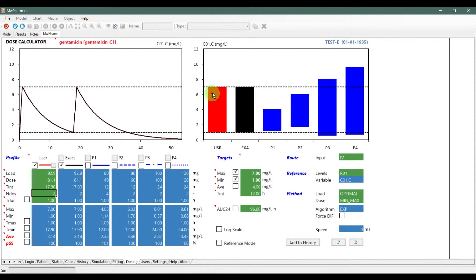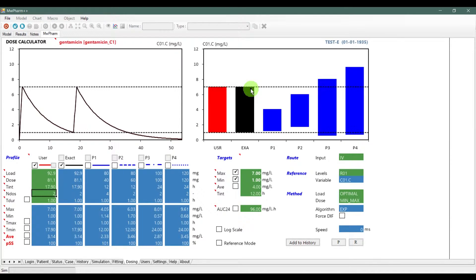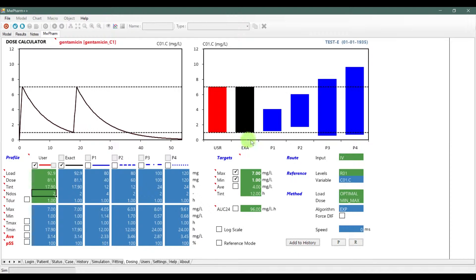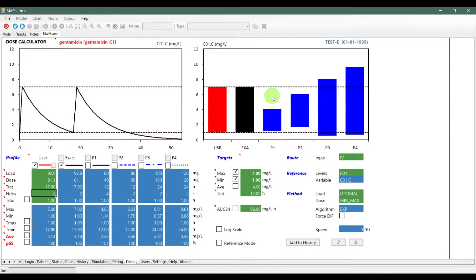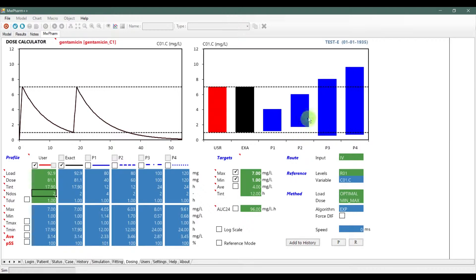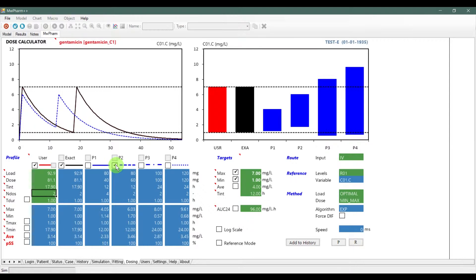On the right side you can see the bar graph. The red column is your own dosage. The black column is a simulation with the exact dosages. Blue columns are the practice dosages. If you want to select dosing for a patient, it is best to choose dosing in a bar chart which goes slightly above the minimum and ends slightly below the maximum.